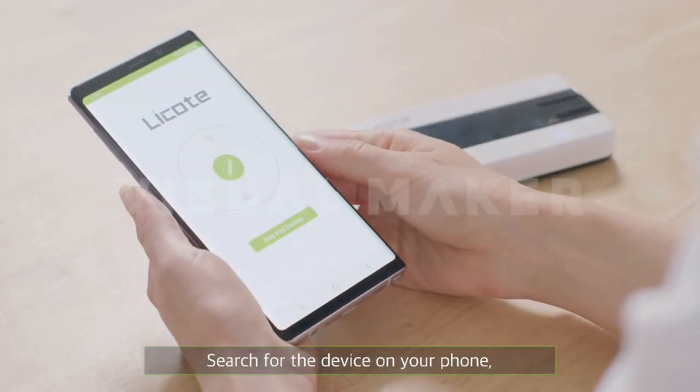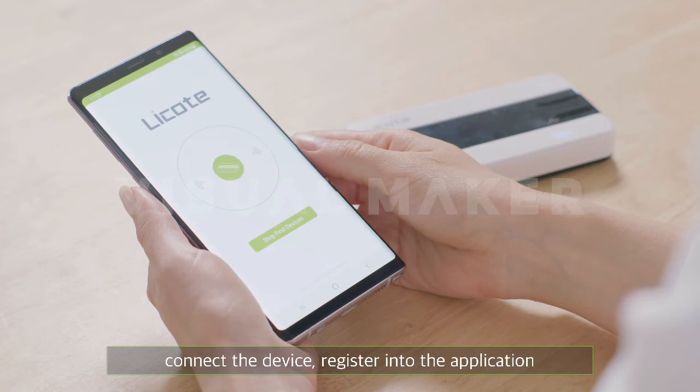Search for the device on your phone. Connect the device and register it into the application.